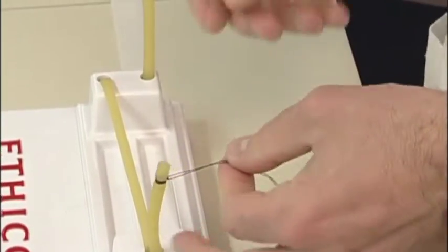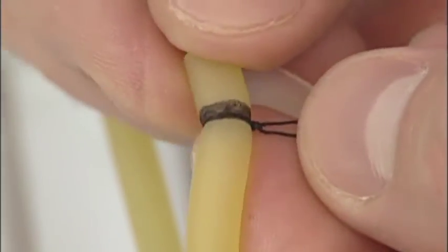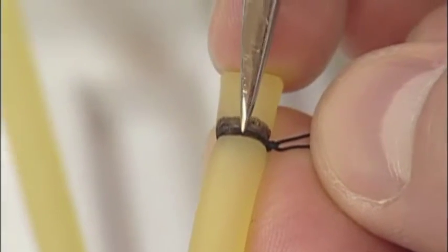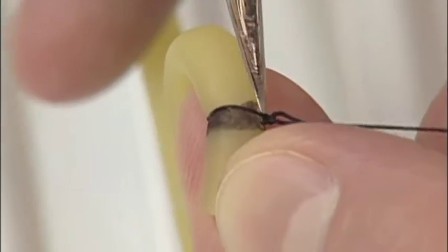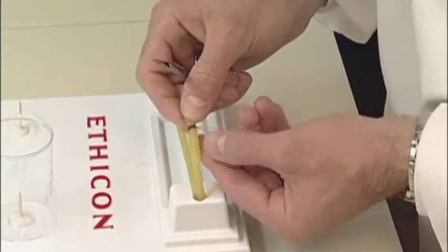We will assess this exercise by looking very closely at this ligature, and we want the entire ligature to lie within the black target zone, which is again about a 2mm distance. And we can look circumferentially. We can flip this to the other side, and I'm pretty close to the edge on one of these aspects, but it is in fact within the colored target line.